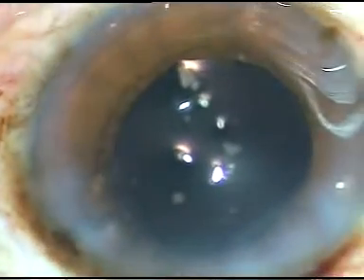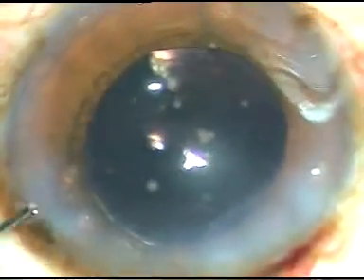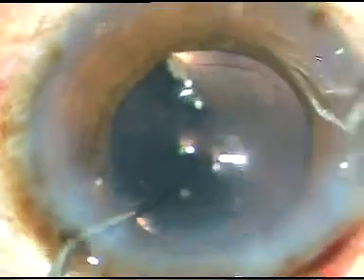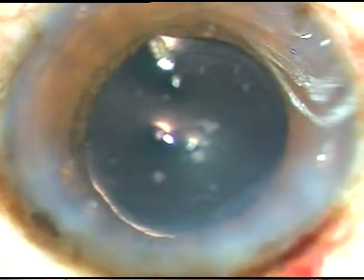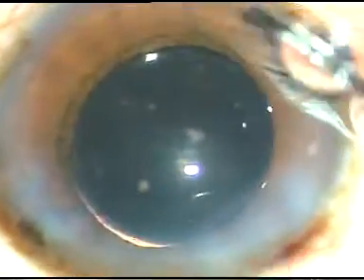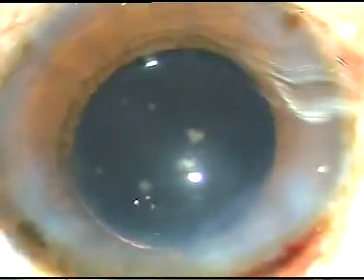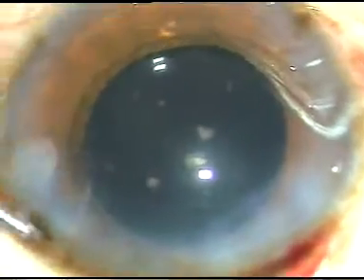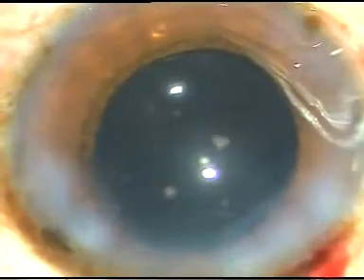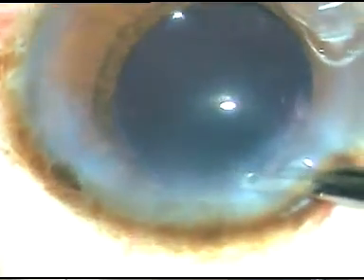Now, this is moxifloxacin — a little bit of moxifloxacin is injected, and I hydrate the side ports. The chamber is formed. Thank you very much for watching.